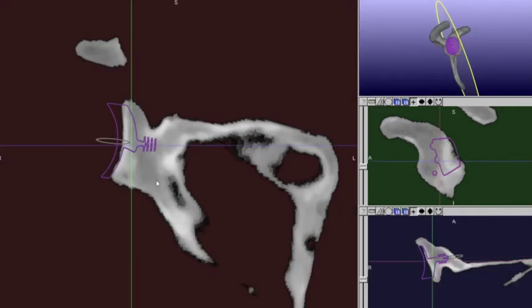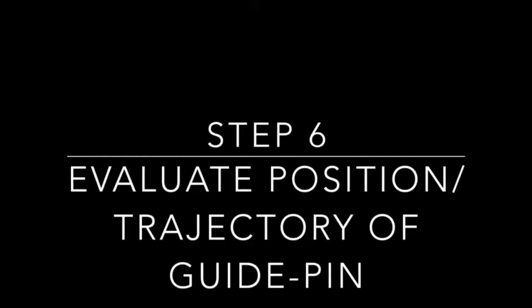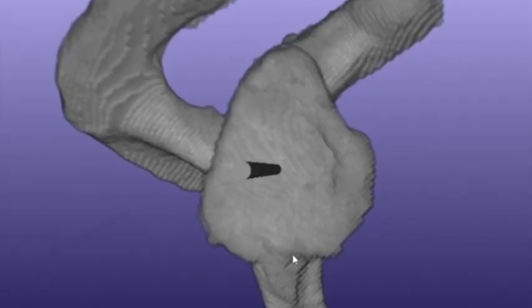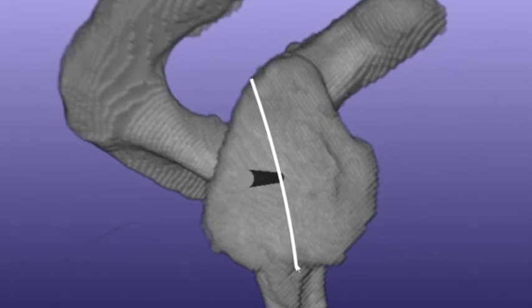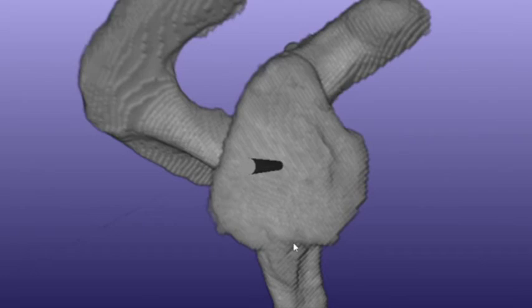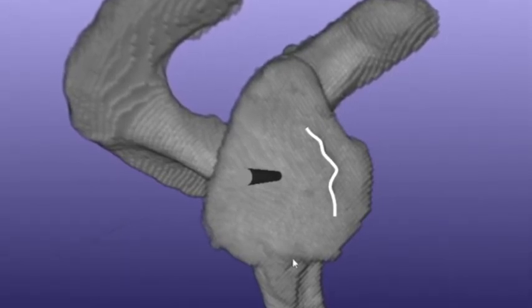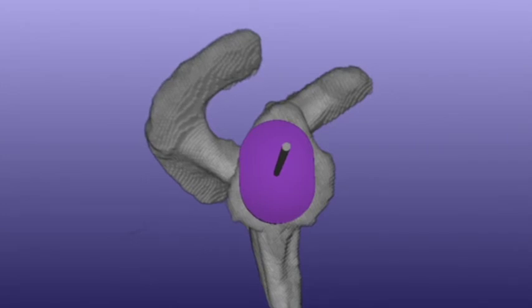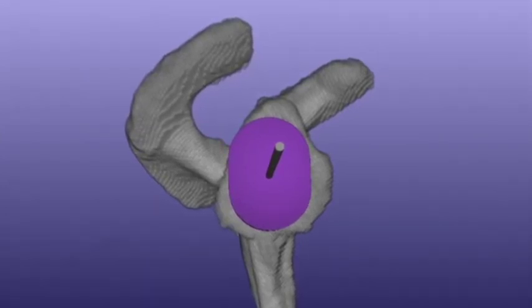We then examine axial, coronal, and three-dimensional images to ensure the implant is fully seated and that we are recreating our goals. The next step is to evaluate the position and trajectory of the central guide pin once the implant is in its final position. We evaluate the axial and 3D en-face view of the pin relative to the biconcavity of the glenoid. In this case, the pin sits directly on the biconcave line, though this is not always the case. We also look for other identifiable bony landmarks — in this case, the patient has a discrete apex along the inner margin of the anterior osteophyte, and the pin is directly across from this apex.